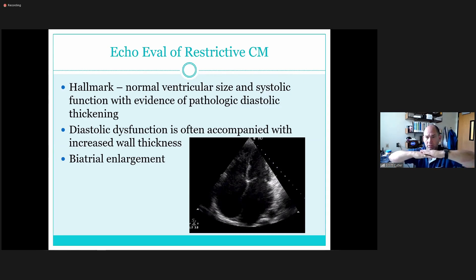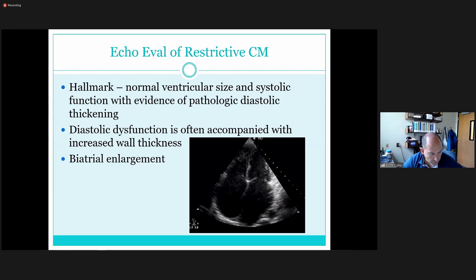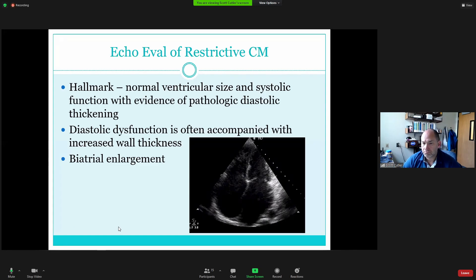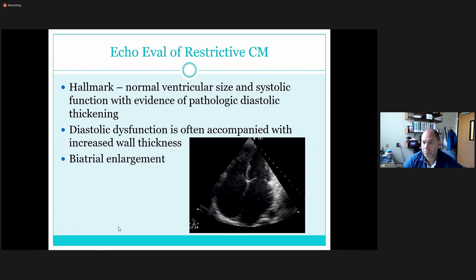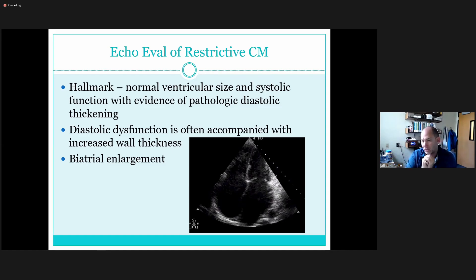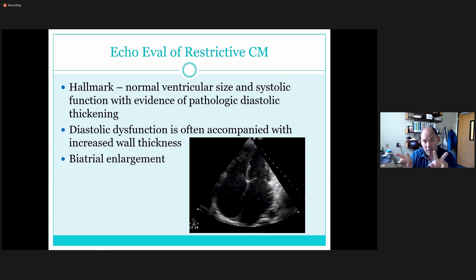That foramen ovale tissue is not fused together, so as we stretch it, those two membranes pull apart and reopen that hole — so you definitely want to look at that. What views and measurements do we want to quantify atrial chamber sizes? We do LA volume, and for the right atrium we do major and minor measurements. In our lab we measure volume on both atria. The major-minor method is important to practice because some labs still do it that way bilaterally — it's also needed for registry — but normally you'd measure a full volume.